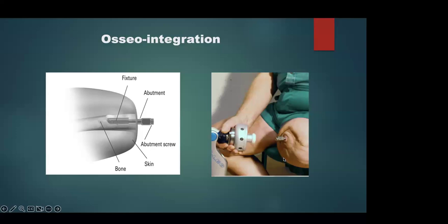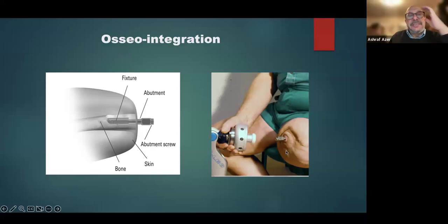And then he will be wheelchair bound for a period of time anyway till the clear. And what we have here is what we call a fail-safe device. And this is a problem in the UK. A fail-safe device is that when a patient has a fall or a disruption of the mechanism, instead of falling and breaking this bone, there will be a fail-safe device. It will crack before.